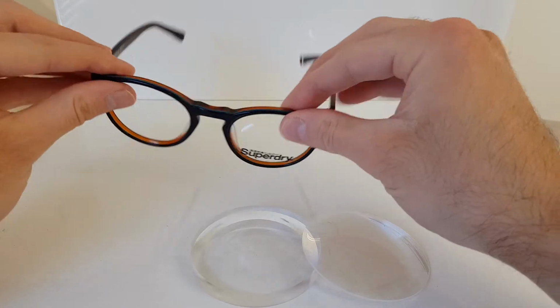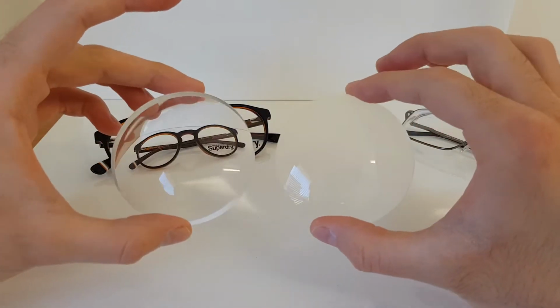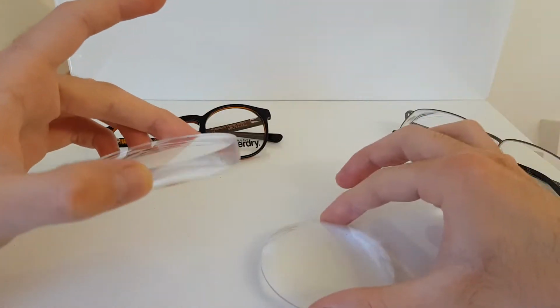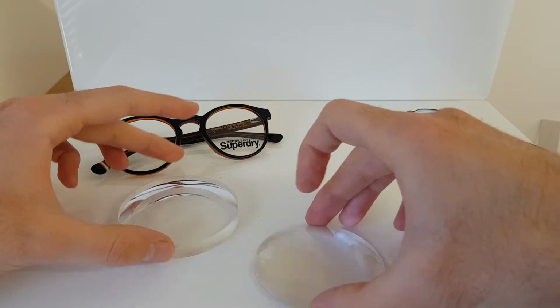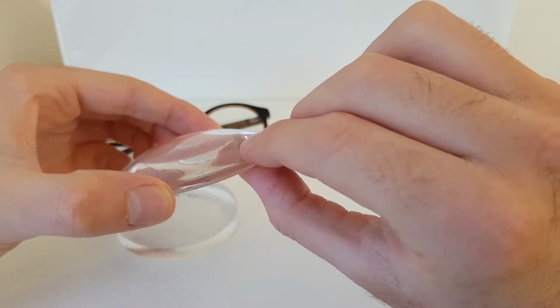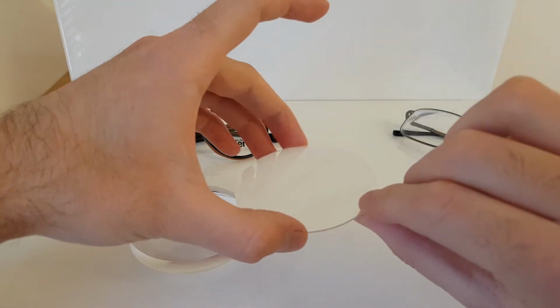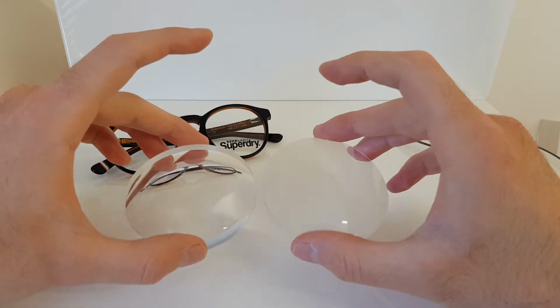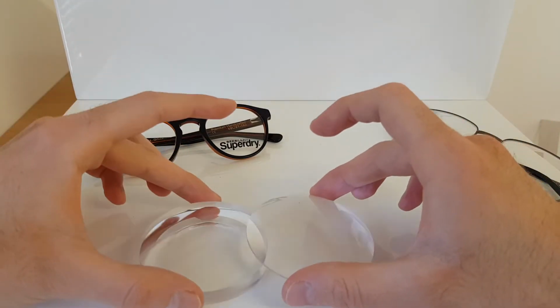So if you have a high prescription, you'll be used to seeing one of these two types of lenses. A high minus prescription is thick at the edges and thinner in the centre, and a high plus prescription is thinner at the edge and thicker in the centre. Okay, now both of these are just a standard material lens, which is why they're really thick. And when they're thick, they also become heavy. There's two ways that we can make these lenses thinner.